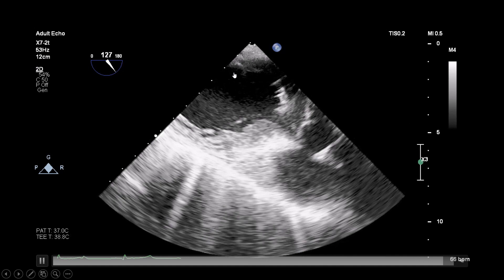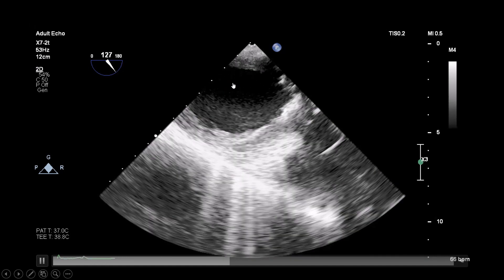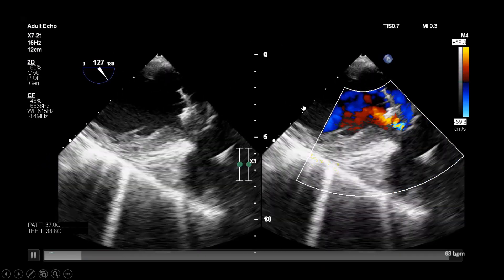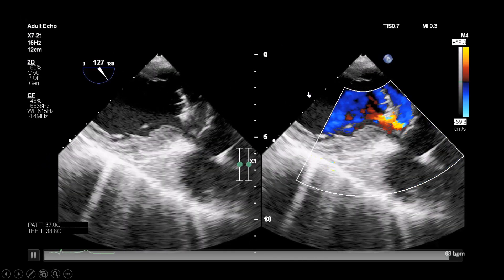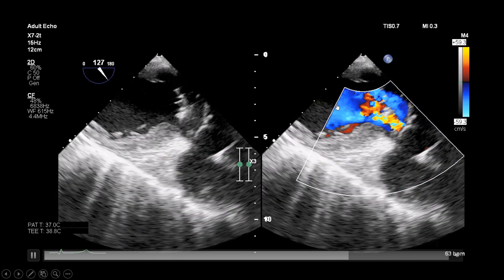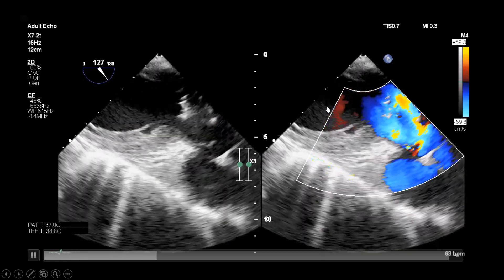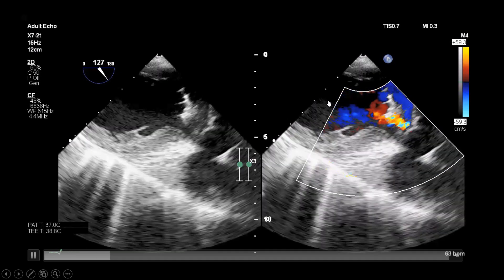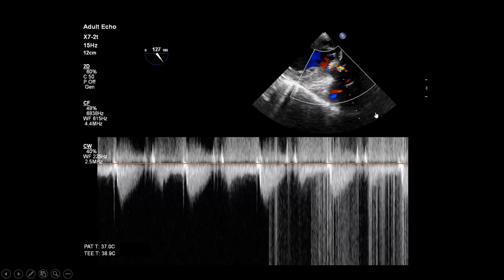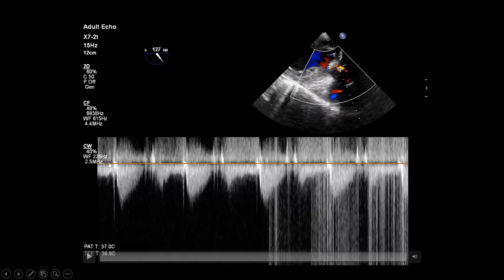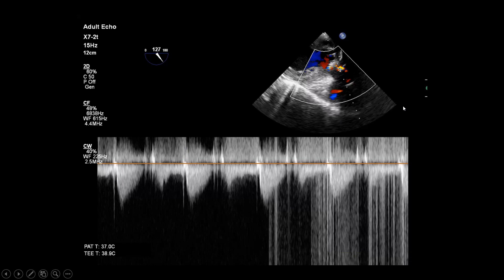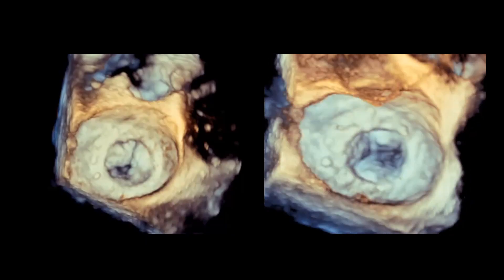Going down to the stomach — either deep transgastric or long axis mid-gastric view — you can see the LVOT and the prosthesis. With color, there is some aortic regurgitation which was present from the beginning. Otherwise, there is no flow acceleration through the LVOT, which you can confirm with Doppler as well. This is a very low velocity, confirming no LVOT obstruction — a common complication that you must check for.